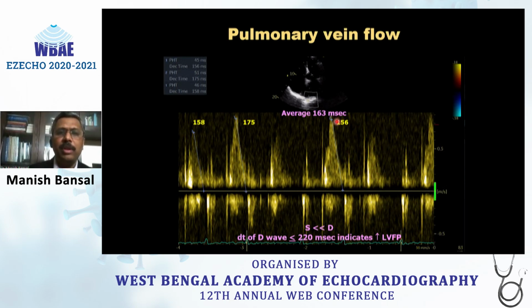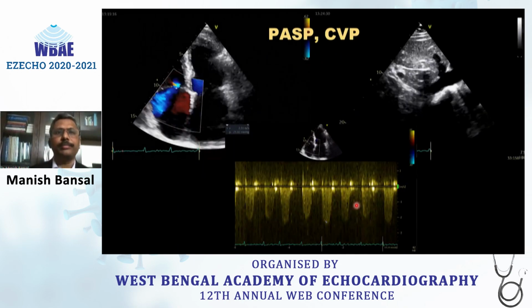And we can measure deceleration time of D wave also. So here it is roughly 160 milliseconds. Anything less than 220 indicates elevated LA pressure. So all these parameters are indicating significantly elevated LA pressure.